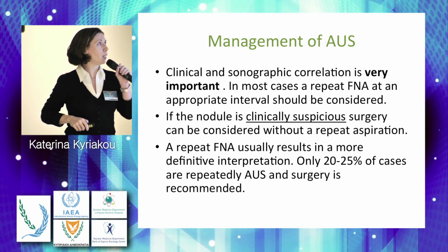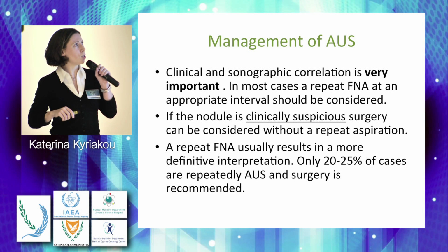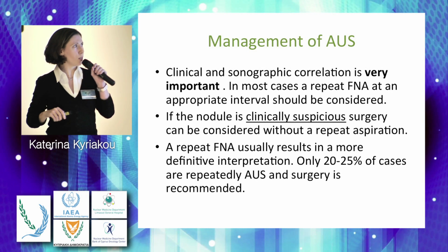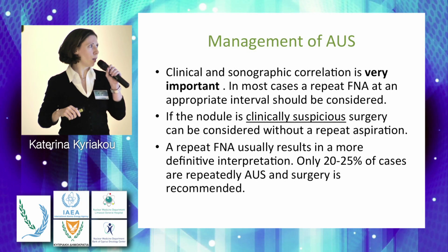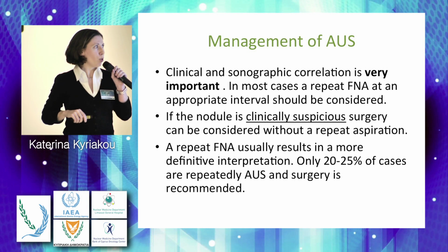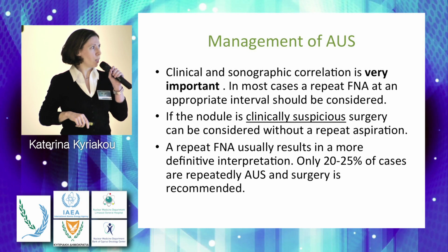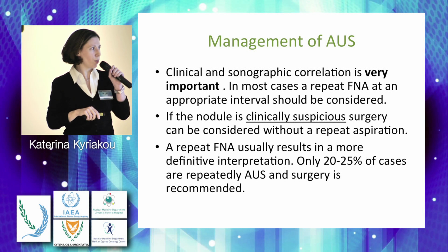The management of atypia of undetermined significance: we have to have a clinical and sonographic correlation. It is very important. And in most cases, repeat FNA will solve the problem. If the nodule is clinically suspicious, and sonographically it is a suspicious lesion, then surgery can be considered without a repeat aspiration. And a repeat FNA usually results in a more definite interpretation, and only 20 to 25% of cases are repeatedly atypical, and where surgery is recommended.